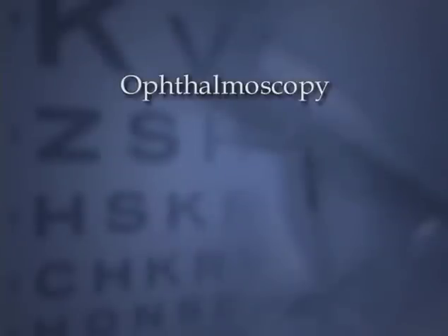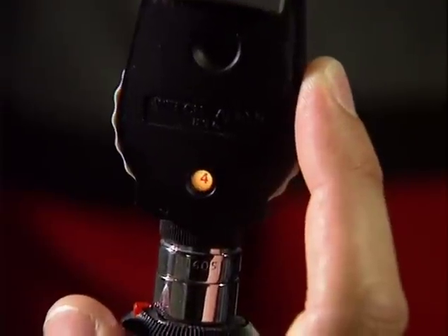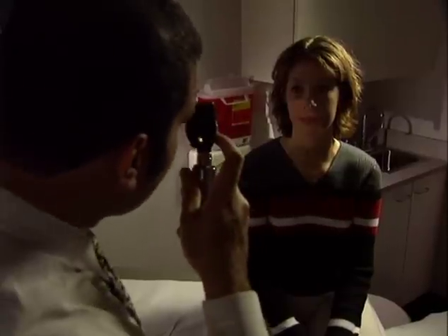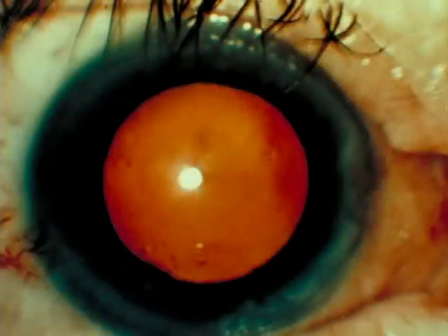Ophthalmoscopy can be divided into two steps: the examination of the red reflex and examination of the retina and optic nerve. First, set the power on the ophthalmoscope to 0. Now, look at the red reflex of both eyes at the same time from a distance of about 1 meter. There should be a crisp, clear, symmetric reddish-orange reflex from both eyes.